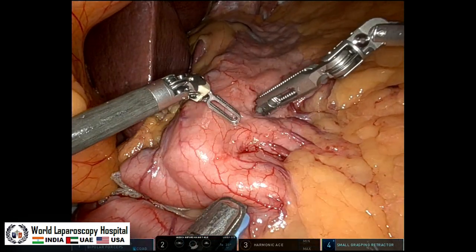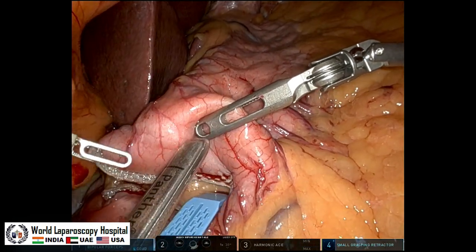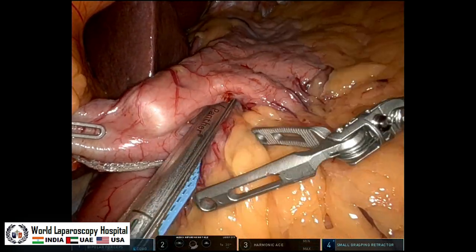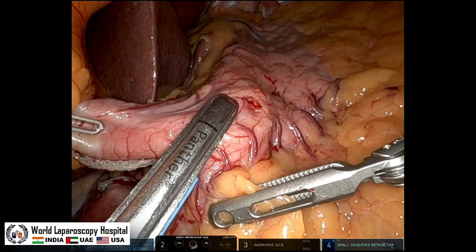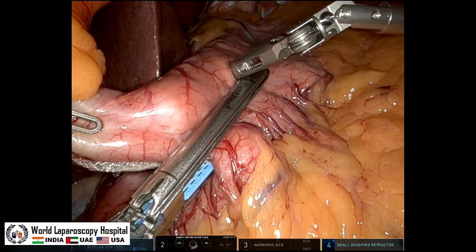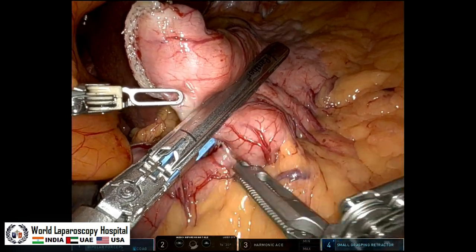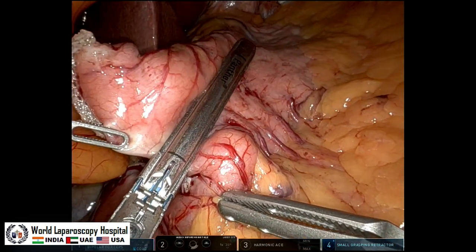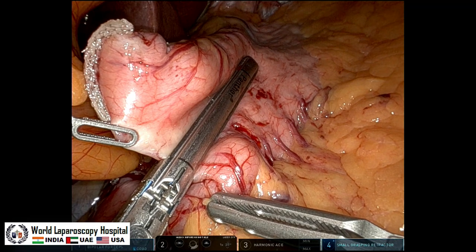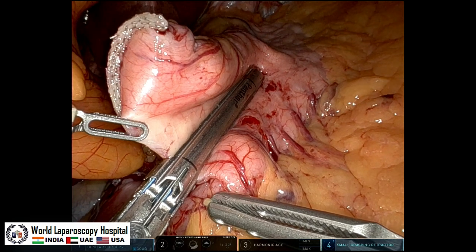Now we adjust the GCT again. Through the same port, you see, this is the next firing. And here, very important thing while doing firing laterally and making the tube, when you are closing the stapler, you should rotate it a bit anti-clockwise slightly and slide it laterally, slightly. Even if somebody cannot observe it, you do it. Because of that, you can prevent the twisting of the pouch. It's a loose pouch. It's not very accurately calibrated around the GCT, because that's what you need in MGB.